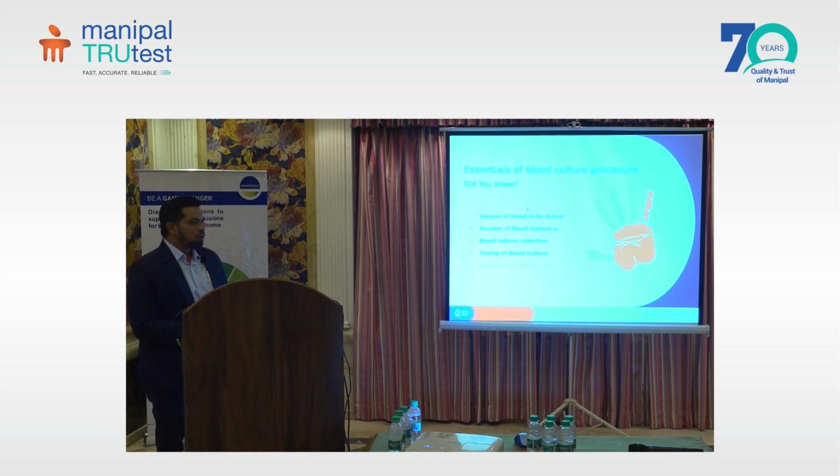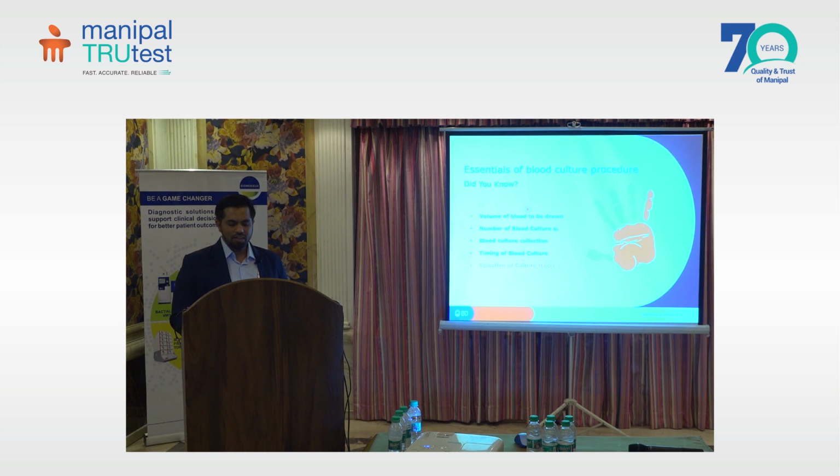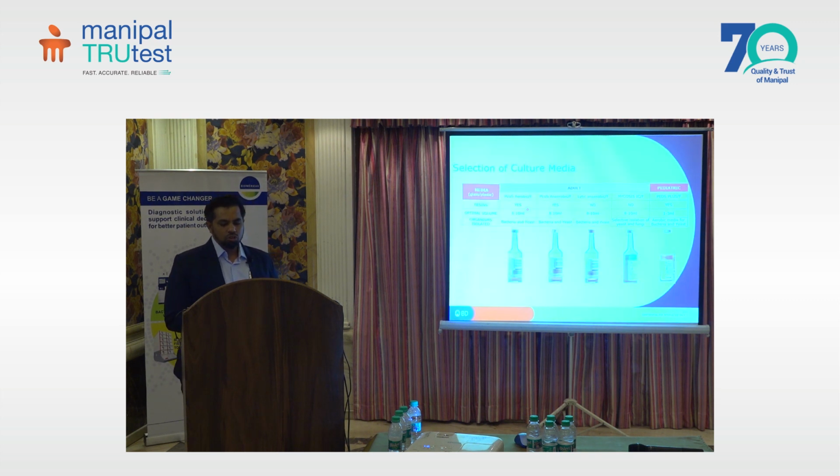The next is selection of the culture media. So why is the selection of the culture media important? A wide range of blood culture media are available in the market, such as Aerobic Plus, Anaerobic Plus, Lytic Anaerobic, Myco/F Lytic. I will take you through this.